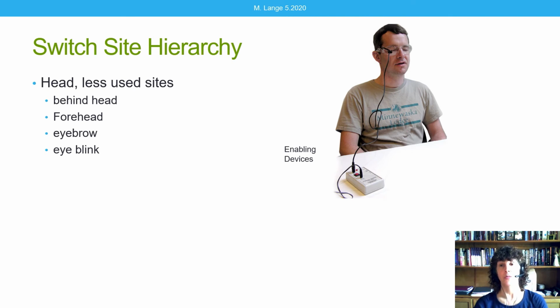Also, if I just want to rest and put my head back on my head support, I might accidentally activate the switch. It's important our clients have a position of rest. It is possible to put a switch right in front of the forehead, but I now have to drop my head forward and release, and that can be a difficult movement. But I have had one client in the past who did very, very well with that placement.